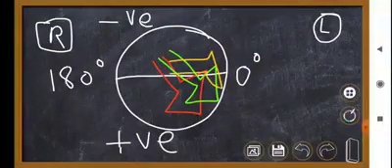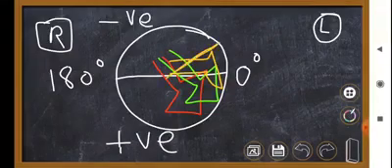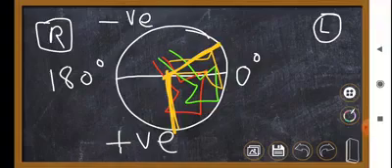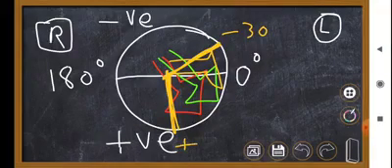So normally these variabilities exist, so we conclude that in a normal person, the normal axis of the QRS complex, or broadly speaking the axis of the heart, lies between minus 30 degree to plus 90 degree.